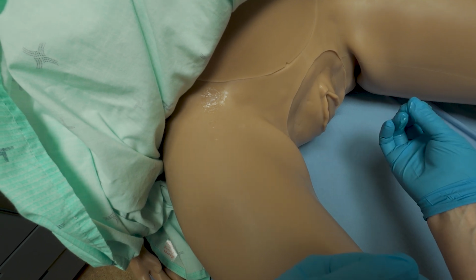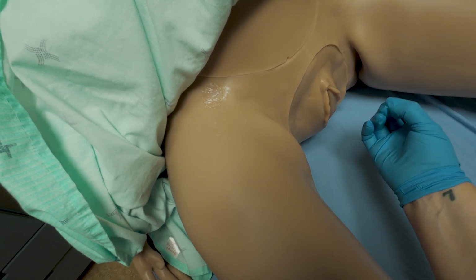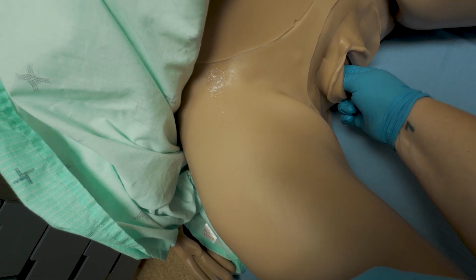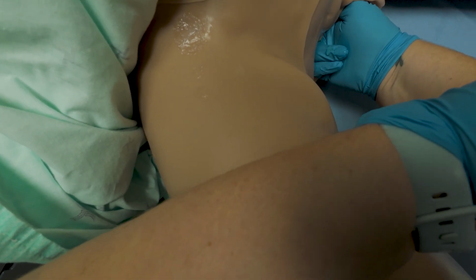You're just going to feel a bit of touch and pressure. If at any time during this procedure you feel too uncomfortable to continue, please just tell me to stop and we'll stop, okay? So you're just going to feel a bit of touch and pressure here while I identify the vagina. Okay, now I can feel the baby's head. I'm having a good feel around.